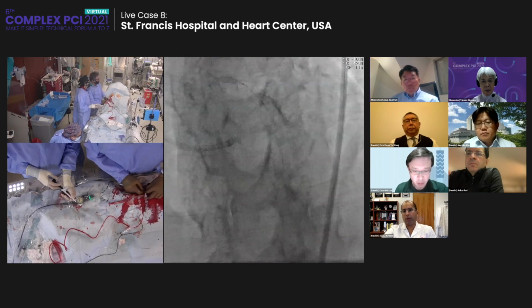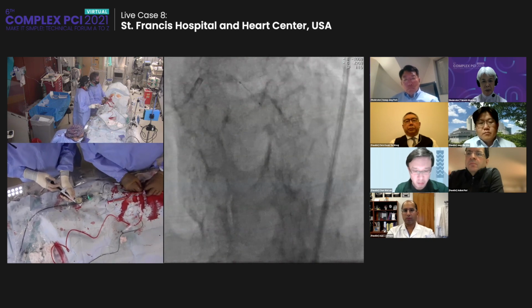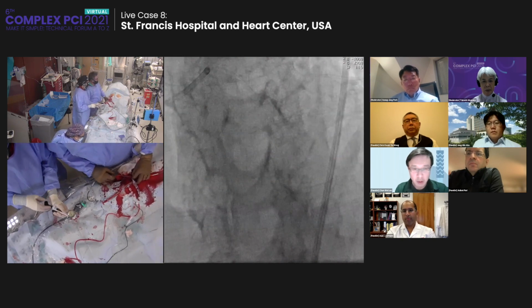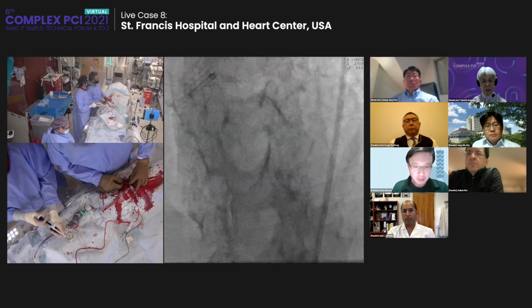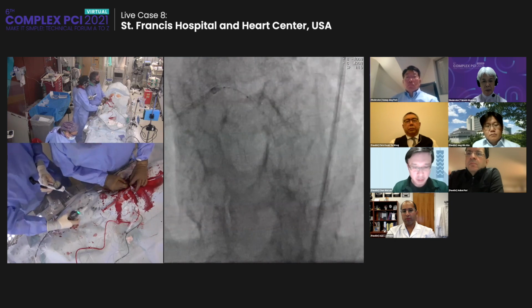Yeah. I'm just going to rewrap this in the guide. Bring it back. I'm just going to rewrap this at a couple of atmospheres to see if it can go. If it doesn't, we won't struggle too much.